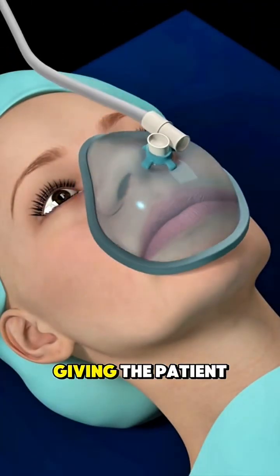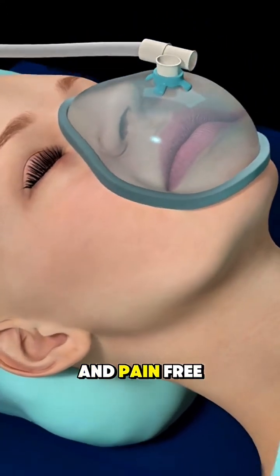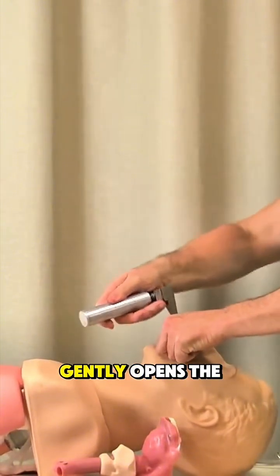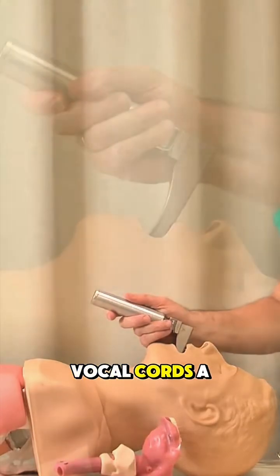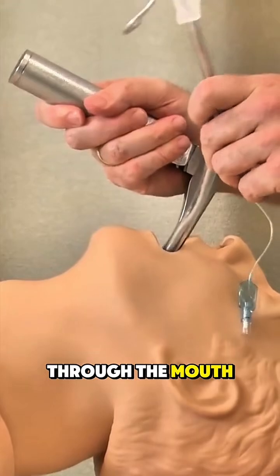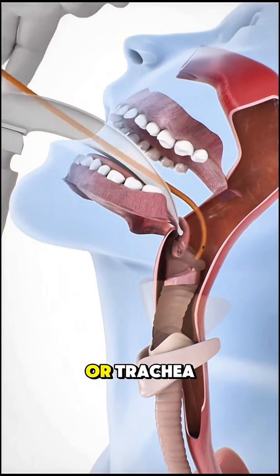It starts with giving the patient anesthesia or sedation to keep them unconscious and pain-free. Then, a doctor or anesthesiologist gently opens the patient's mouth and uses a tool called a laryngoscope to view the vocal cords. A flexible plastic tube is then carefully inserted through the mouth and passed between the vocal cords into the windpipe, or trachea.